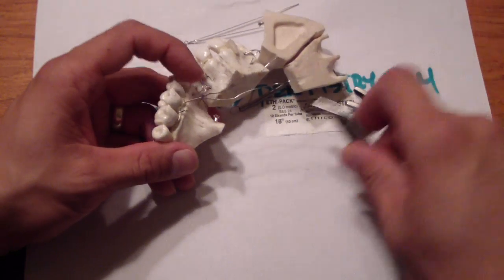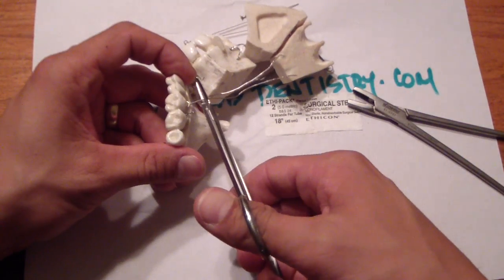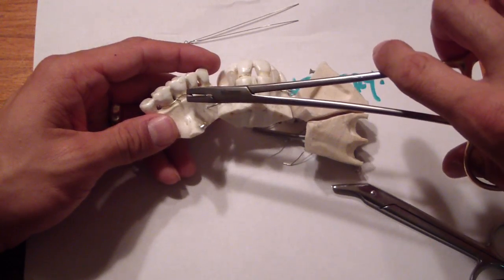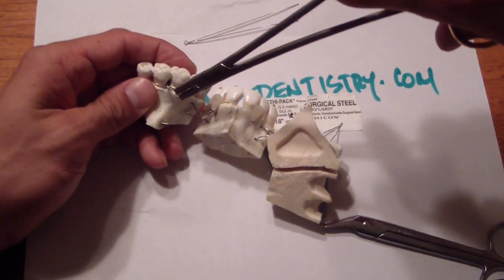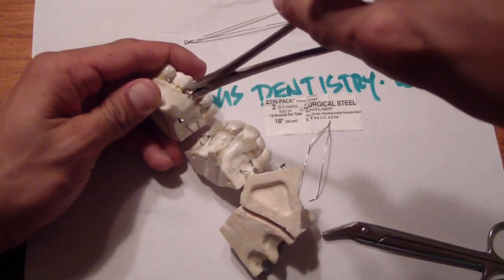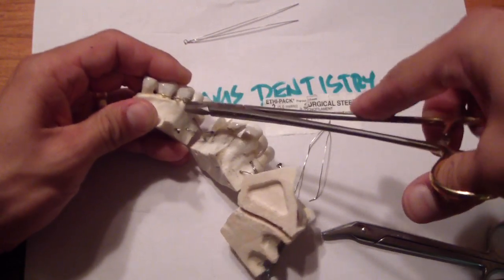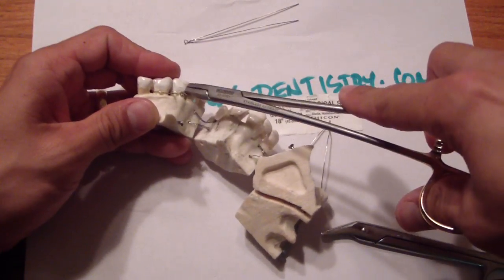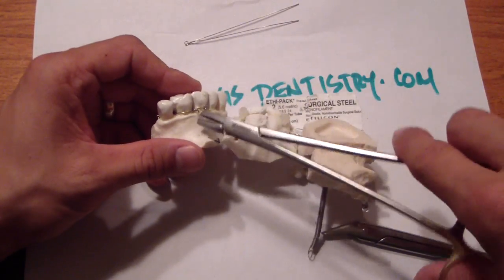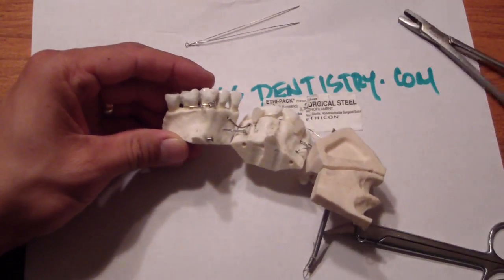So we're just going to snip it. Then you can take your pickle fork — which is essentially a Woodson with a little groove in it. You'll see me use it in the live video. Just take this and make it into a little rosette, then tuck it away, either under the wire or into the interproximal area. You may want to turn this little loop so it's oriented correctly so you can get your wire through.